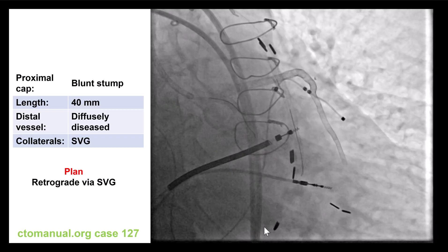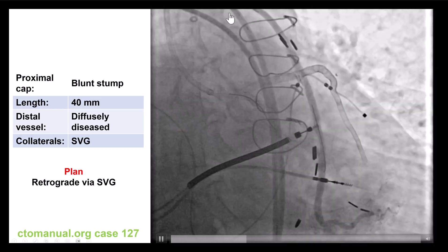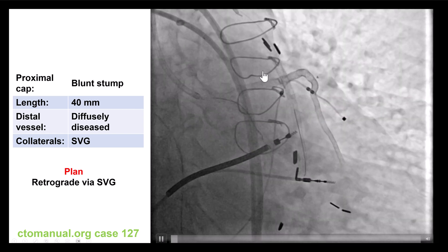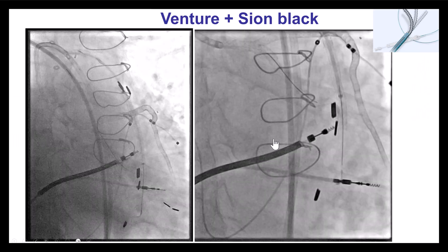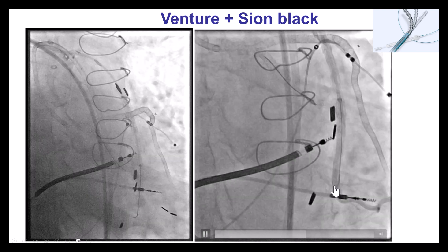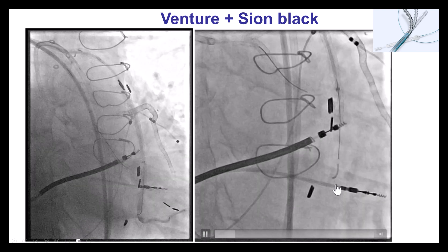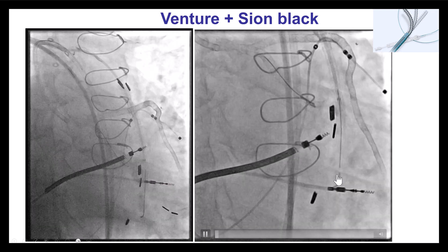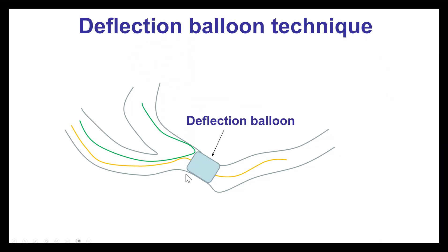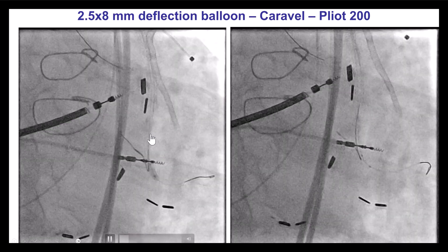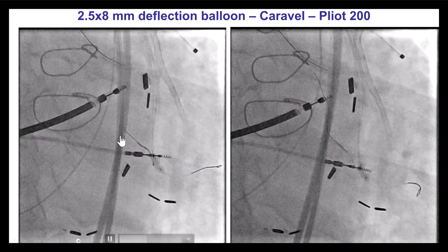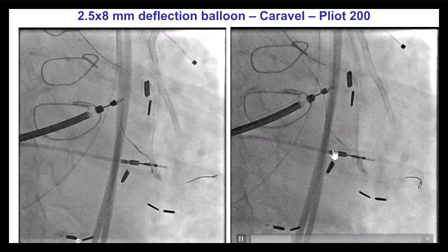This is an example of a deflection balloon. We have this saphenous vein graft going to the obtuse marginal branch. This graft had recurrent failure and we wanted to recanalize the native circumflex. We had difficulty delivering the wire retrograde — the angulation is fairly tight. Despite using a Venture and a polymer-jacketed Sion Black wire, we were not able to do so. But then we inflated a balloon just distal to the vein graft touchdown, and after doing that, we were able to deflect a Pilot 200 wire to go retrograde and then deliver the microcatheter over it.